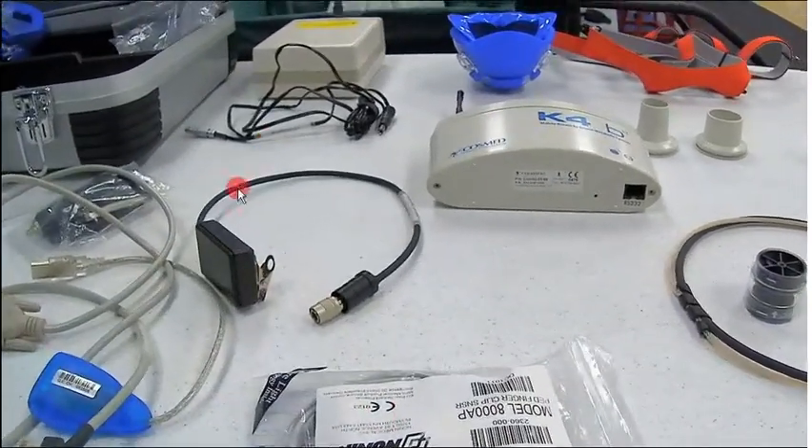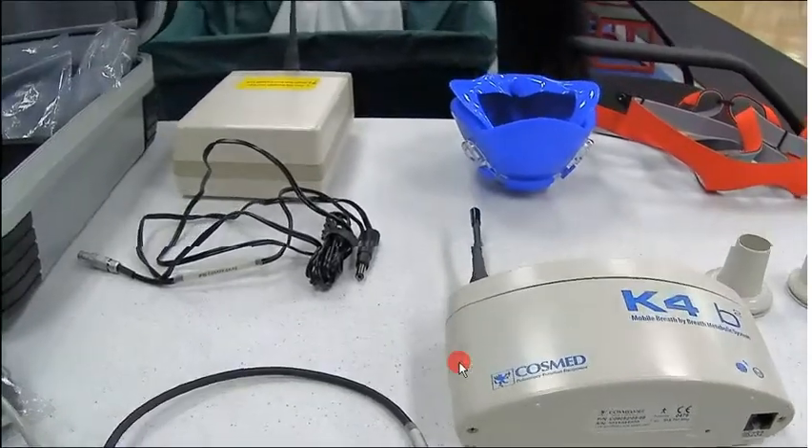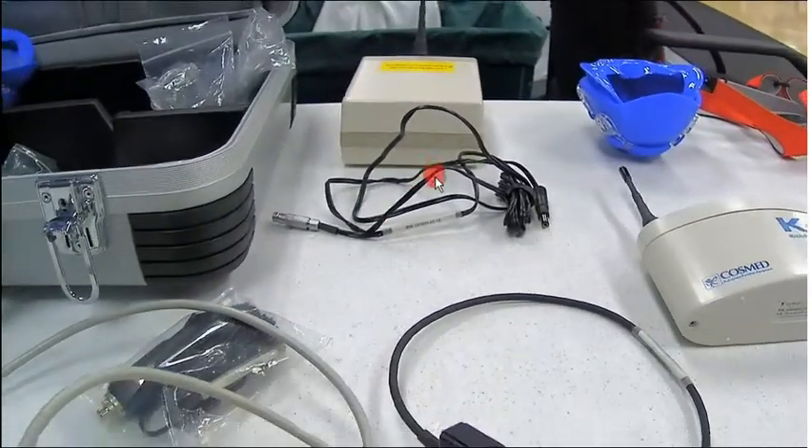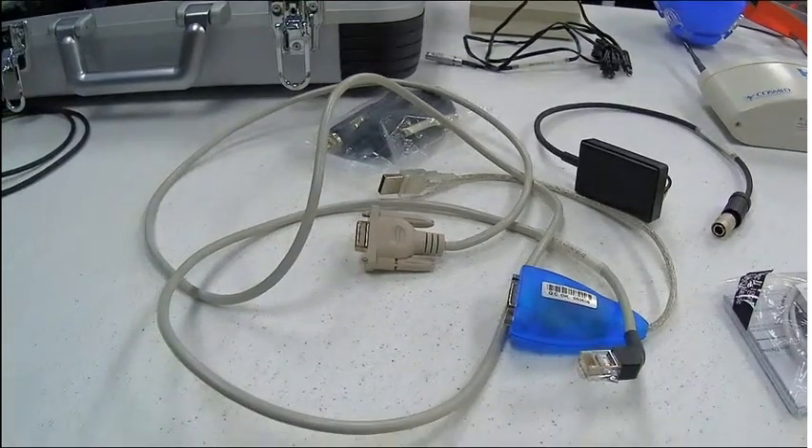We've got the heart rate transmitter, the actual portable unit, the telemetry piece with a 6 volt adapter, and right here we've got an ethernet to USB with an adapter for a 16 pin connector.